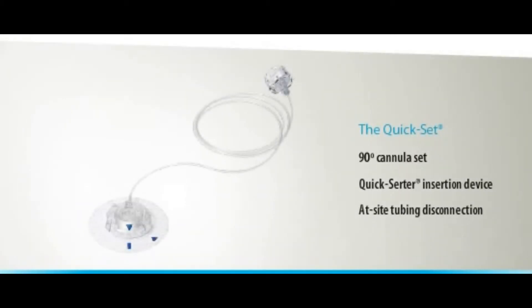The Quick Set offers a soft cannula set inserted at a 90 degree angle, a Quickserter insertion device for consistent insertion depth, and at-site tubing disconnection. You may like the Quick Set if you are of average to heavy build.